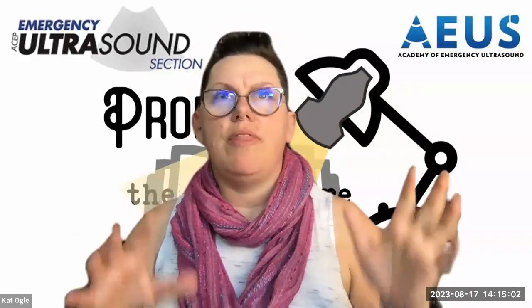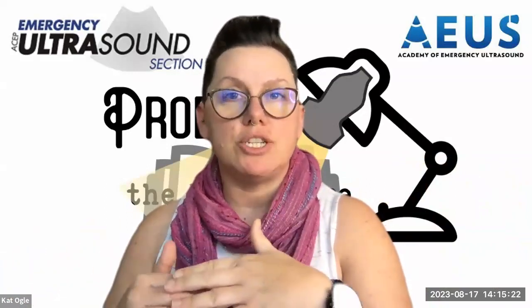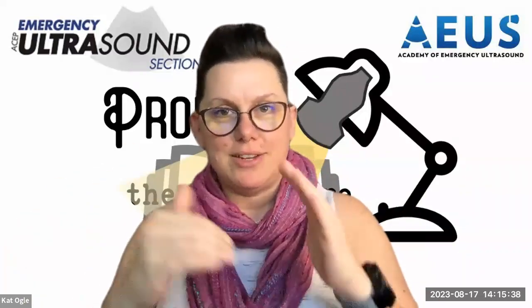And so what that information does for us from a teaching perspective is that it allows us to go back to our residents and really talk about some of the pitfalls of doing the FAST exam and the things that we have to be mindful of, and how you really do differentiate between things like the double line sign and a pericardial fat pad and seminal vesicles when you're teaching them. And so you really talk about the fact that your free fluid in the belly should be fully anechoic. It should tuck into corners, adjacent to structures. It shouldn't be uniform in size. It shouldn't be symmetrical, because you're really tucking in all the nooks and crannies inside the peritoneum.